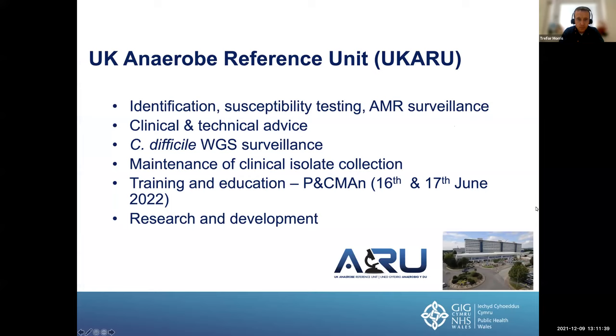So the reference unit that I run has been involved in all of these aspects over many years now. We primarily focused on ID and AST, certainly more so on AST nowadays due to MALDI and the advances in identification. We also have a clinical lead who can give clinical advice, and we are the central reference laboratory for Wales in terms of all things C. diff. We have a large collection, which we've used some of for the purposes of this work alongside other colleagues. We also provide a training course, which is running in the UK, hopefully next year, COVID permitting.